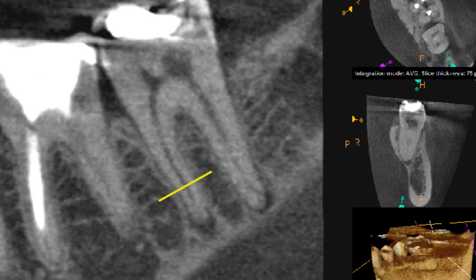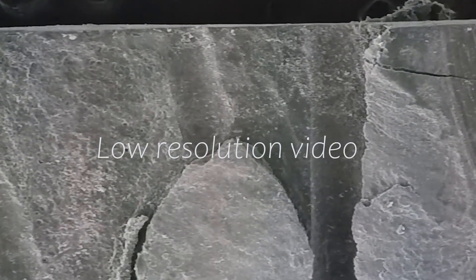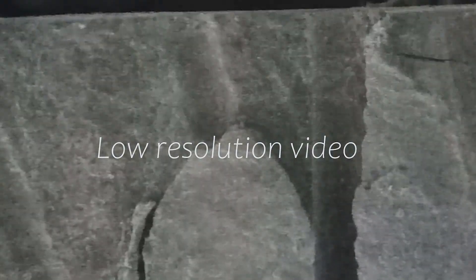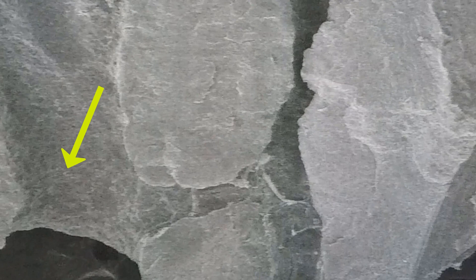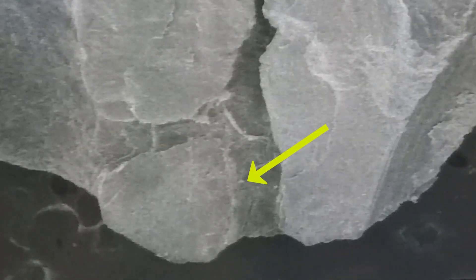There were lesions around both the mesial and distal roots. We decided to evaluate the mesial root and sectioned it. You can see from the sections that there is a mesial buccal and mesial lingual canal. The canals were instrumented only with the 1704 rotary file — that's the only instrumentation done — to really test how well the GentleWave procedure actually cleans a minimally instrumented canal. We're going to look at the apical end of both the mesial buccal and mesial lingual canal.